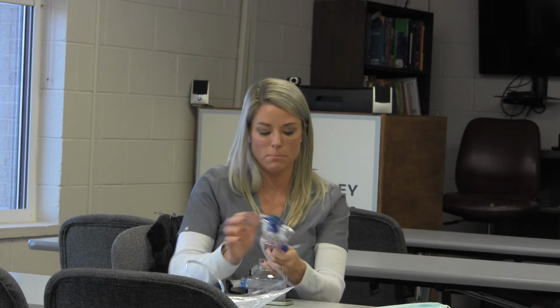Where do the nebs hook into this? It's just a standard T-piece fitting that you would fit into this. Yep. I think Boundtree sells them, but it's just a standard fitting. If you guys are using the Hamilton V60s, they do have a valve that you can hook up to the V60s.